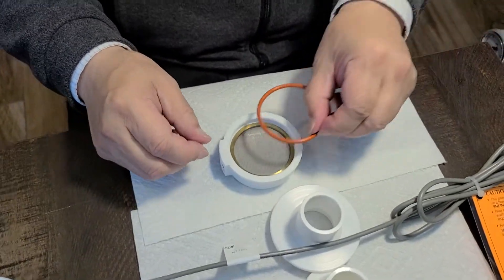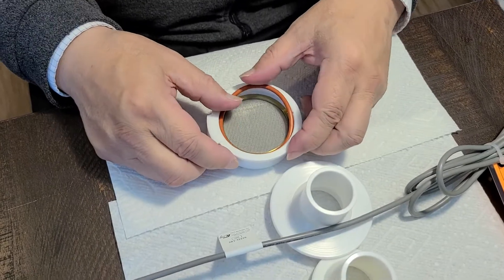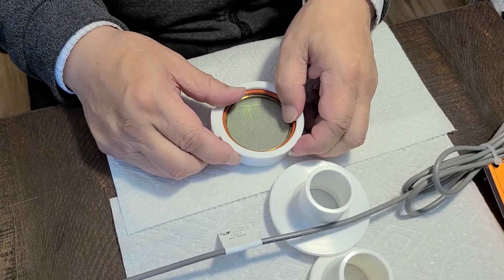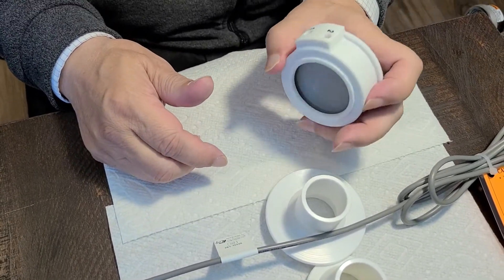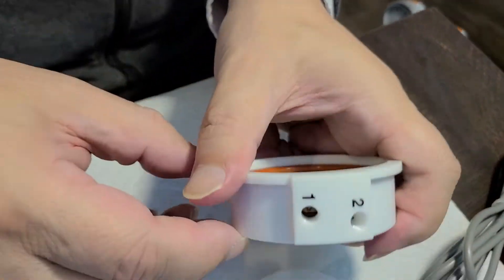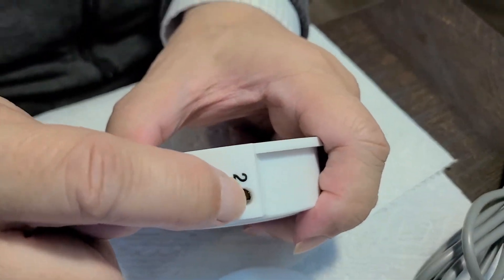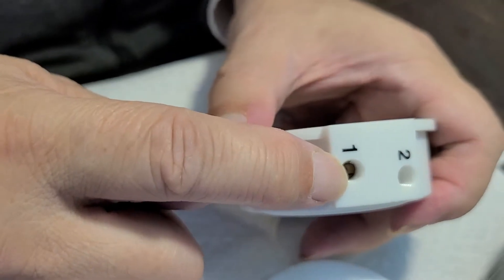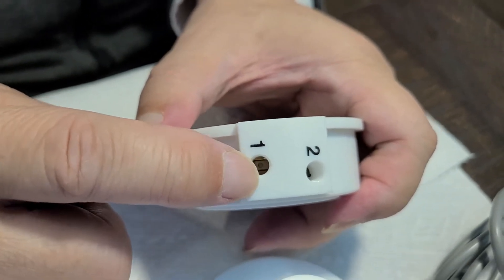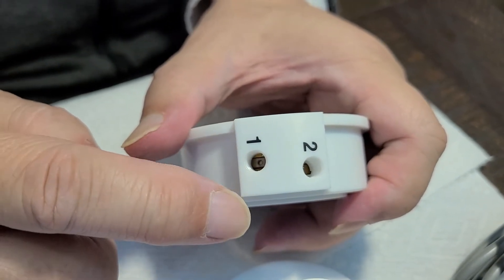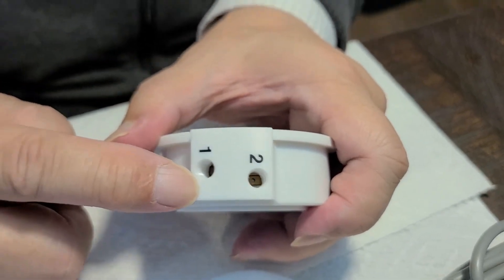Then we put the orange o-ring in place. This time we double check the black holes on screen two and screen one. You should see the black holes. Otherwise, your screen sequence may be wrong.